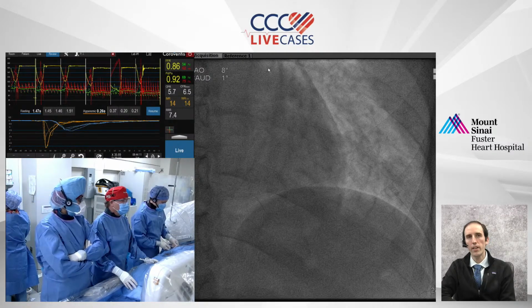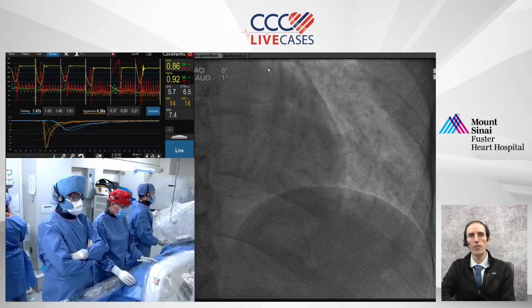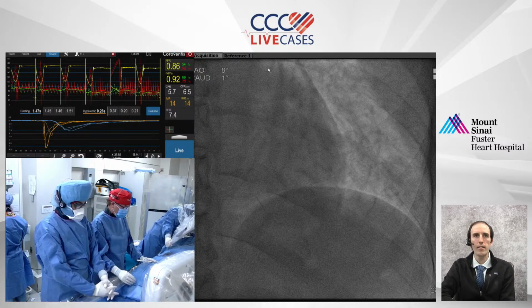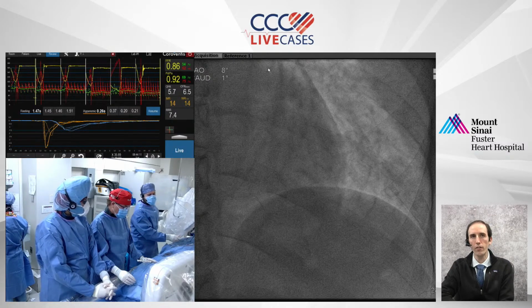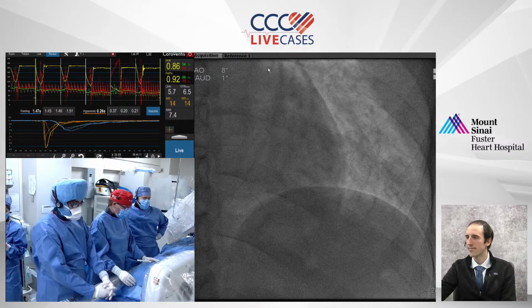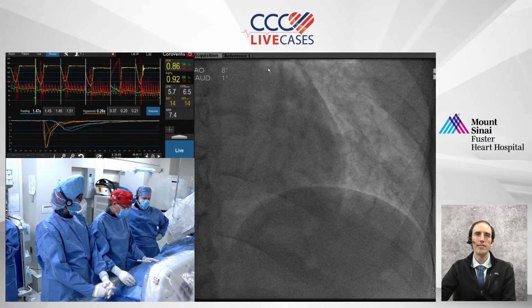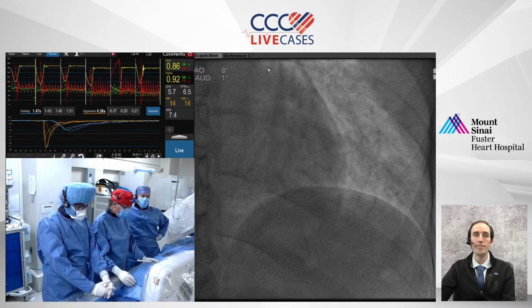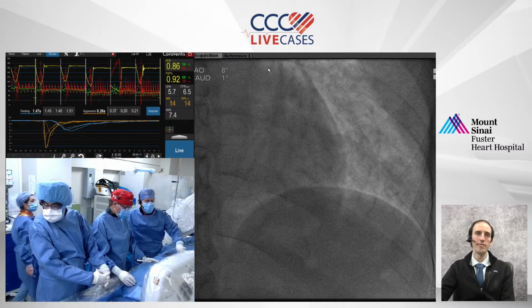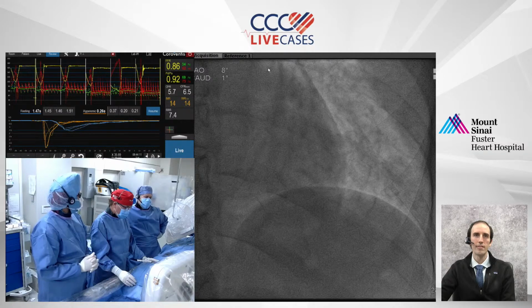Yeah, it's a great point. I think certainly if you have a suspicion of a bridge angiographically, it makes sense to go down that road. In somebody without visual evidence of a bridge, I think it's unlikely that you're going to find a positive bridge, but certainly that is always a possibility. It's another live case for sure. Yeah, and Nat, Olga presented an amazing case at one of our microvascular meetings of a bridge that she found and taught me so much on how to assess those, and actually doing non-hyperemic with iFR or RFR, not having to use dobutamine, but measuring the bridge index. Just a great talk.